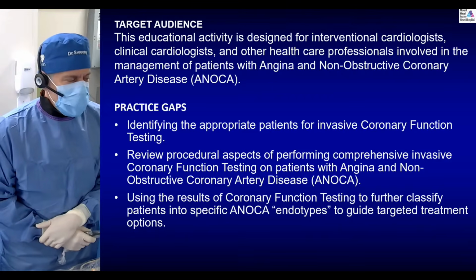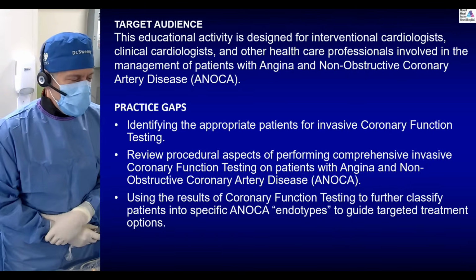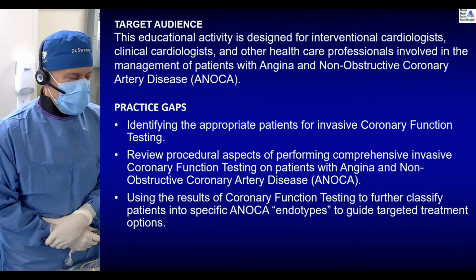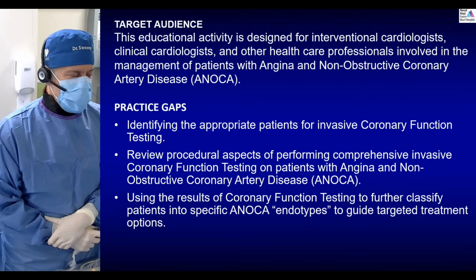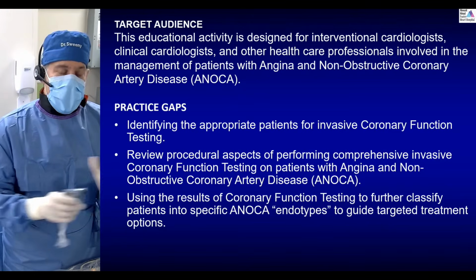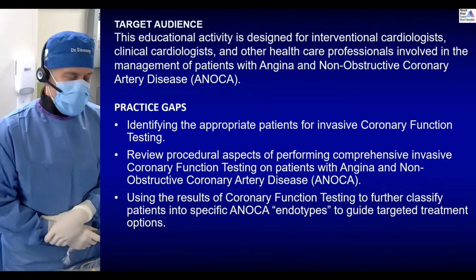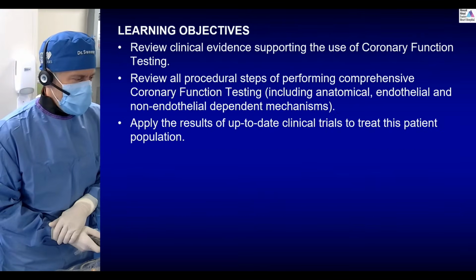We need to review the procedural aspects and have some homogeneity in how we perform these procedures. And really importantly, how we interpret these results to further classify patients into specific ANOCA endotypes. It's those endotypes that help guide our treatment for these patients.